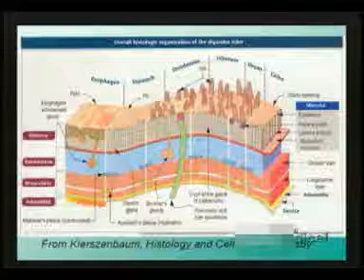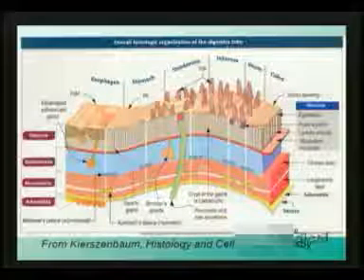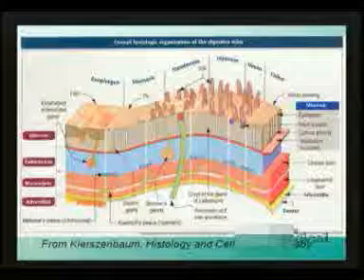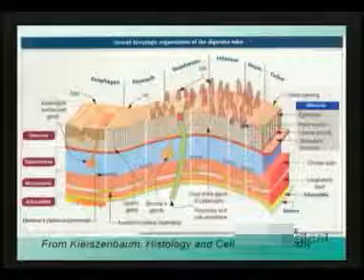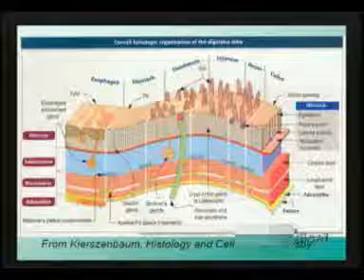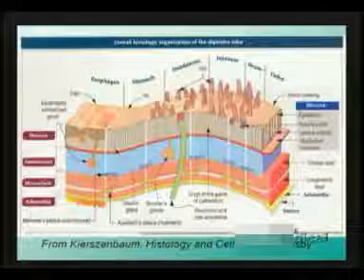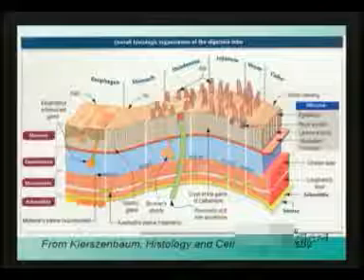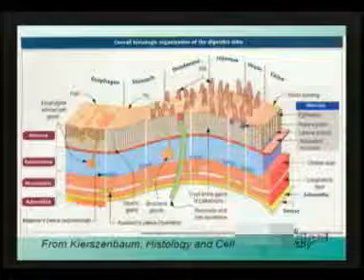The epithelium is simple columnar absorptive thrown into folds or villi, and basically crypts of Lieberkühn characterize all parts of the small intestine. But in the duodenum, the submucosal area will have Brunner's glands. In the ileum, the underlying lamina propria will be characterized by Peyer's patches. In the absence of both, obviously the indications are that you are in a section through the jejunum.